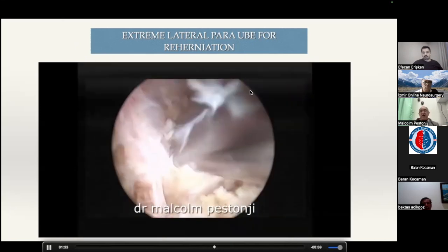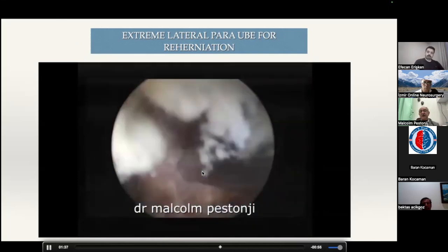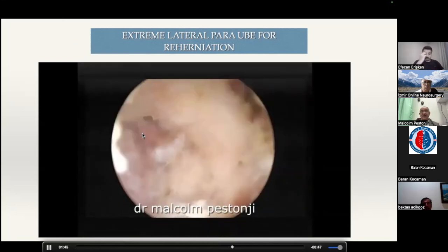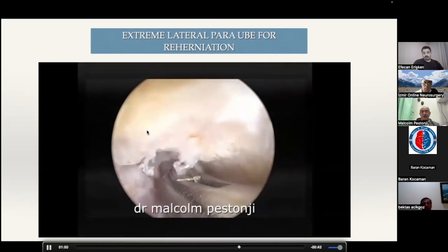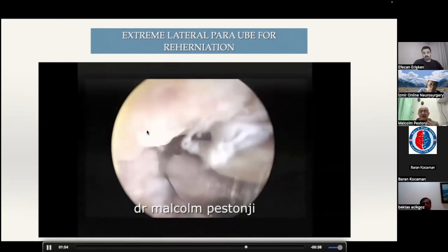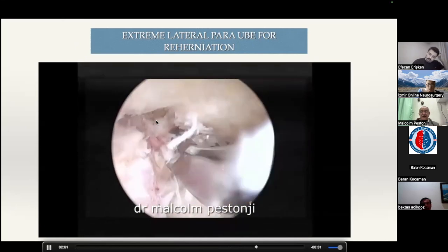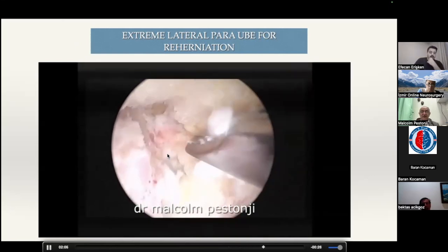But over here, above here, you still see a band on this root. There's something amiss. You have to be careful. And see, when I tear it, you can see how it tears off, and there's a red vascularized tissue there. So I push my scope deeper. I take an arthroscopic punch and I start cutting out that fibrosis which is on the root. You can see the hole below in the disc. That is the remnant of the old scar tissue.